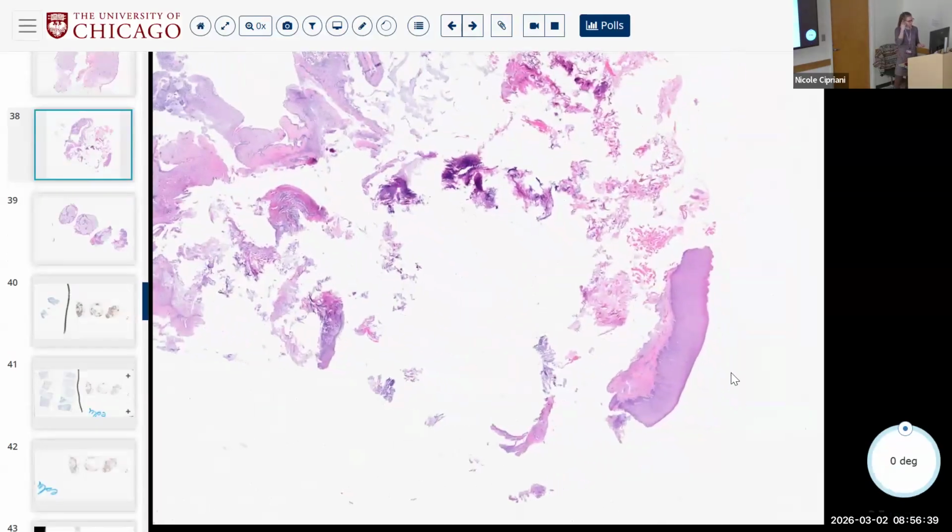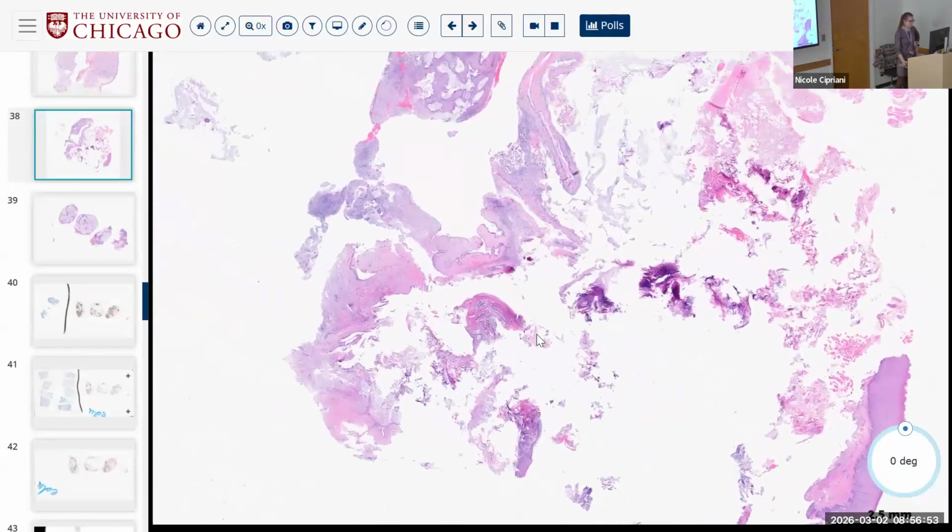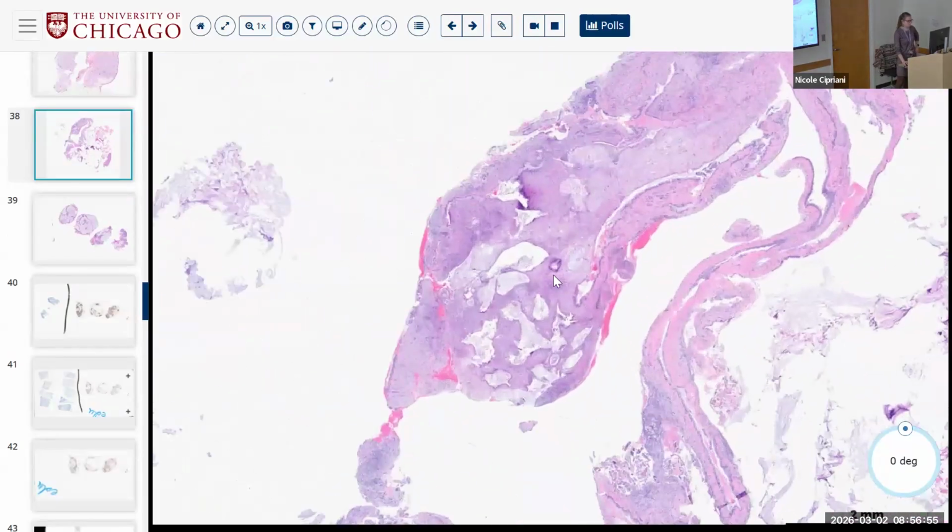All right, now questions. Now we have, I believe, either intraosseous with mucosal involvement or vice versa, but I believe that this might have been one that was focally at least involving bone of the mandible.